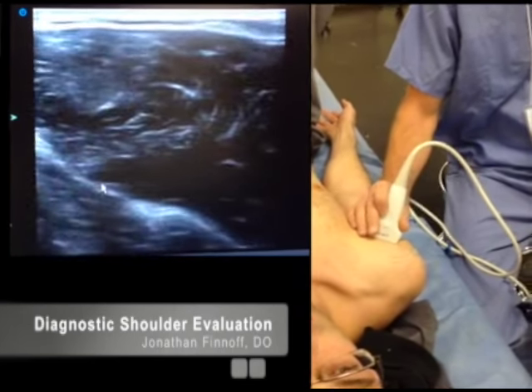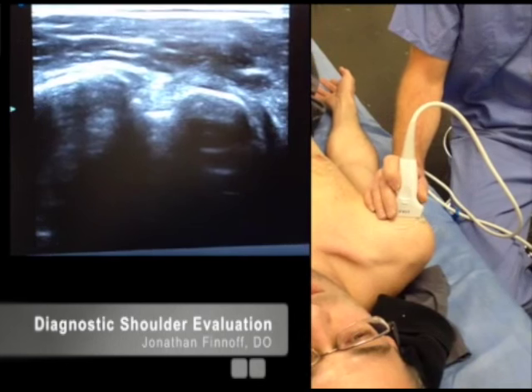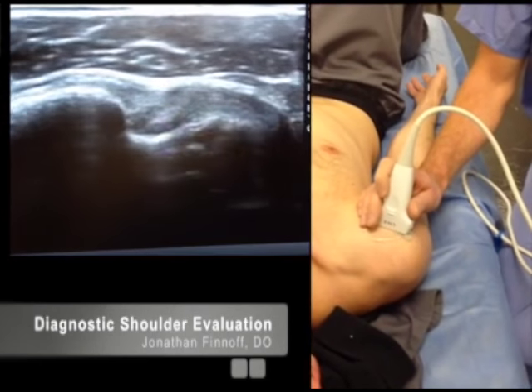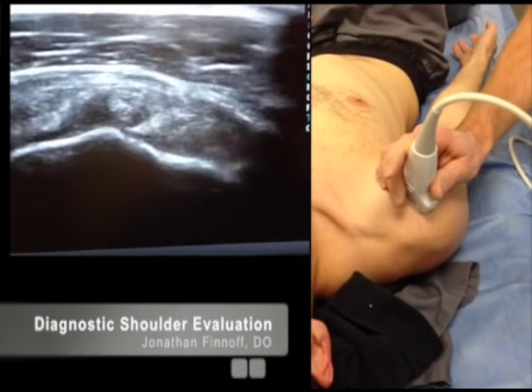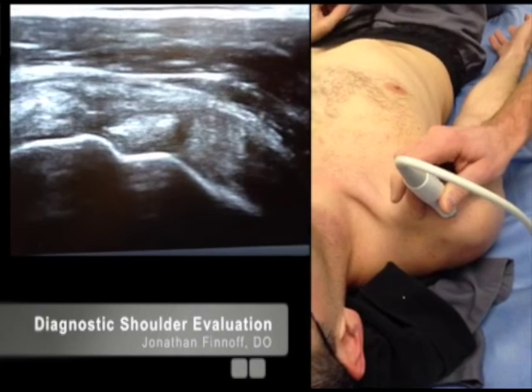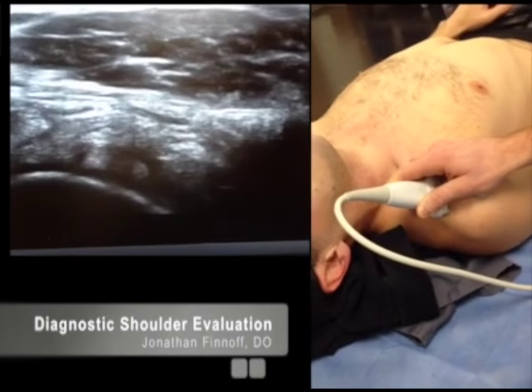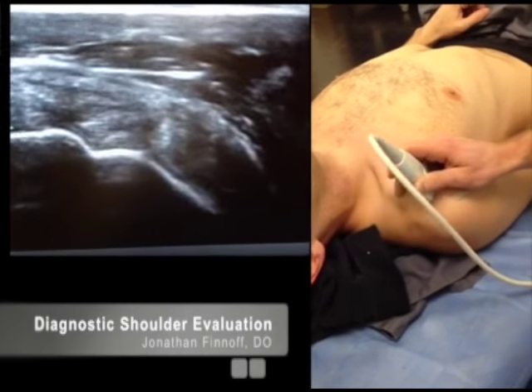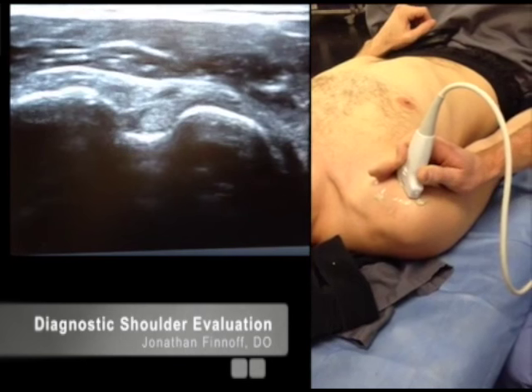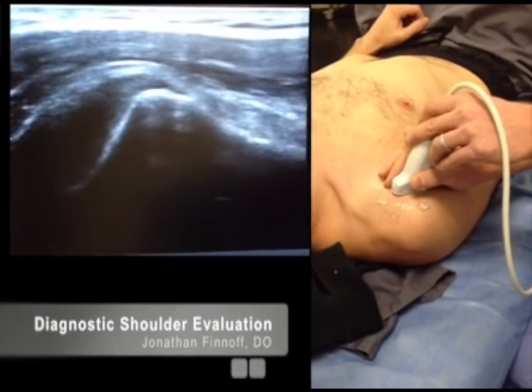Now I'm going to scan back up the biceps tendon, keeping it in the middle of my screen, and scan right up into the intertubercular groove. I'll adjust depth again because the biceps tendon has become more superficial. I'll follow that biceps tendon up, around the corner, and into its interarticular portion. You can scan that all the way up to the point where you hit the acromion. Then I'll come back down, center it in the intertubercular groove, and rotate the transducer to look at that biceps tendon in long axis.